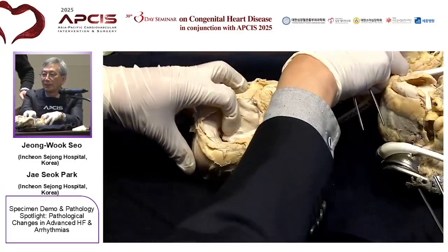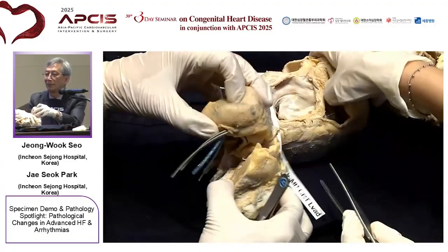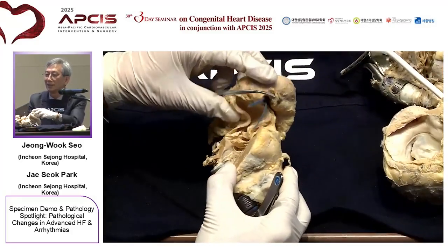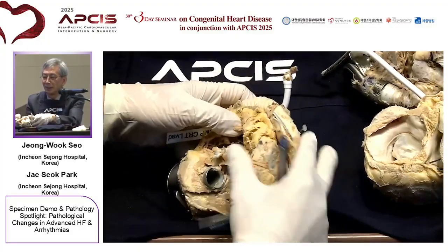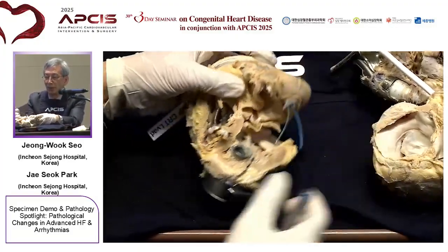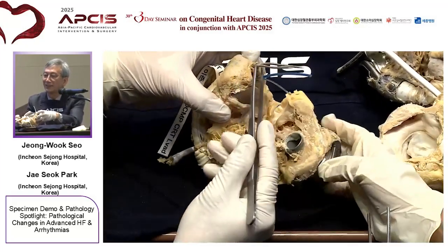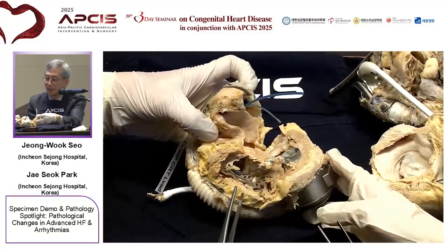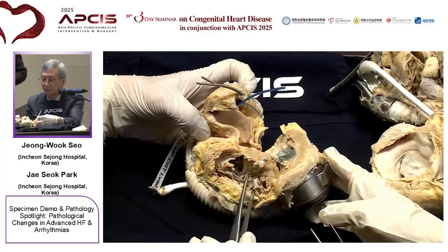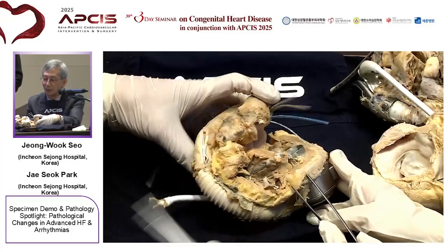And the third case is another CRT lead with many electronic leads in this patient. So when we see this, this is the SVC going to the right atrium and ventricle. So there is a right ventricular lead and another right ventricular lead and a right atrial lead and the CRT lead all together.